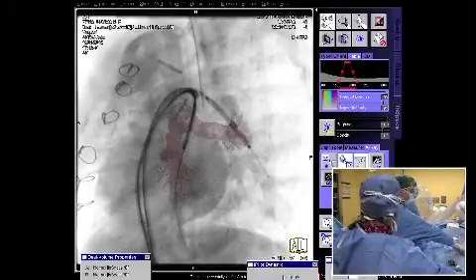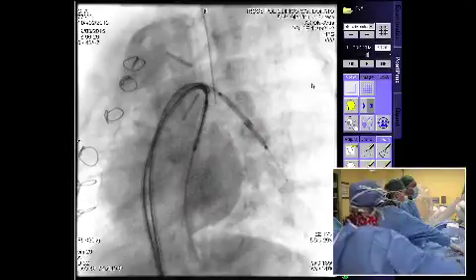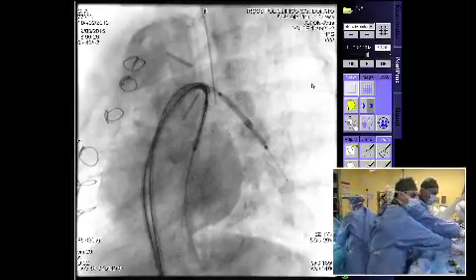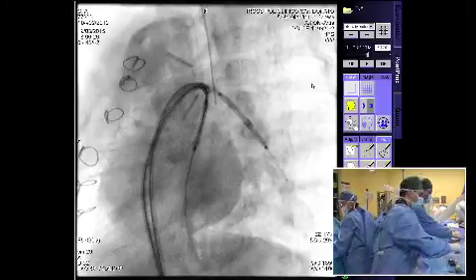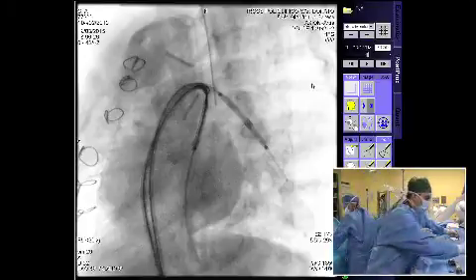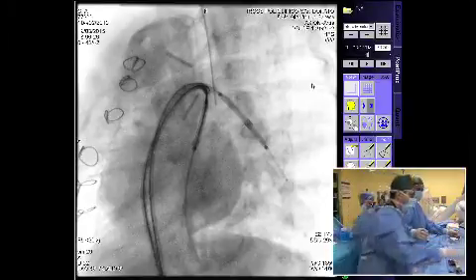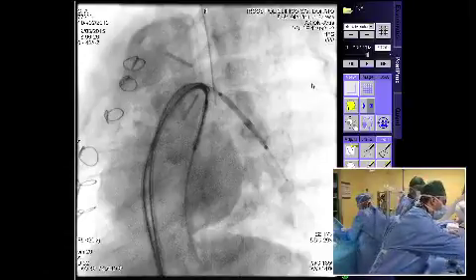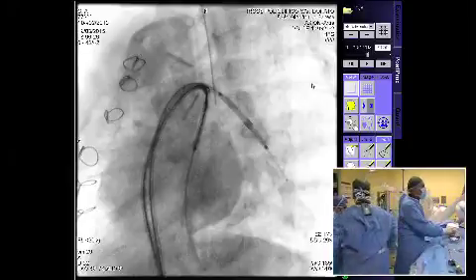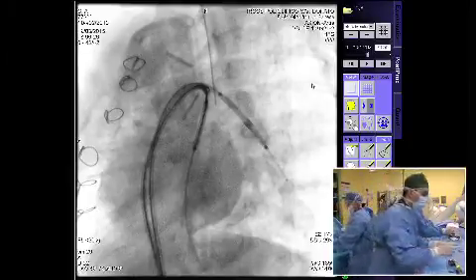So I don't know what your comment is there, because the area at the anastomosis of the branches is also narrow. You need to enlarge that with a stent, and doing the double barrel there, to me, you will have a problem in the future with this child. Well, I think, Gianfranco, that you have to fix the origin, the stenosis of the original both branches, and actually concentrate on that, and we will see in the future.